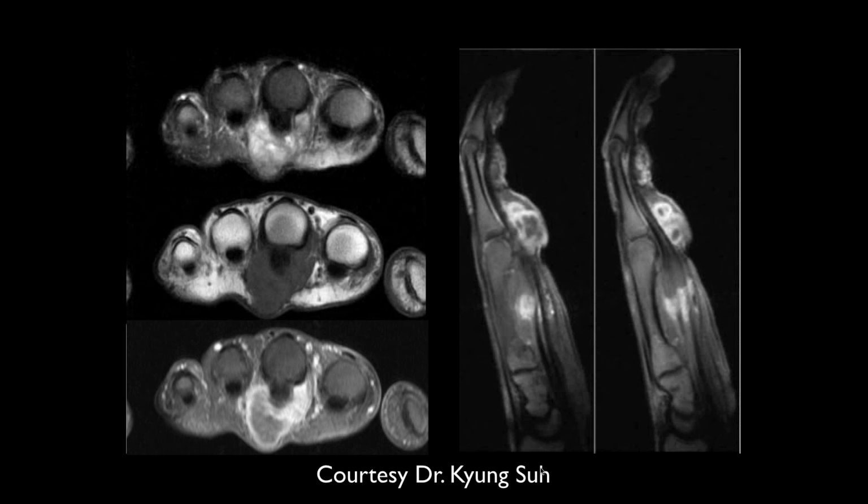It's kind of heterogeneous enhancement along the flexor tendon. I was going to go with a more aggressive giant cell tumor, but this is like a sarcoma. Yeah, this turned out to be an epithelioid sarcoma.